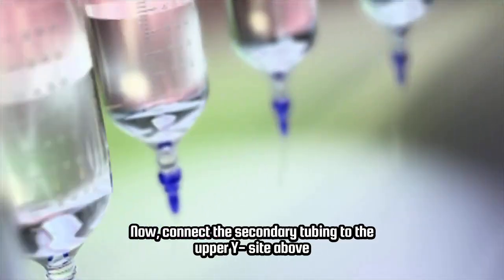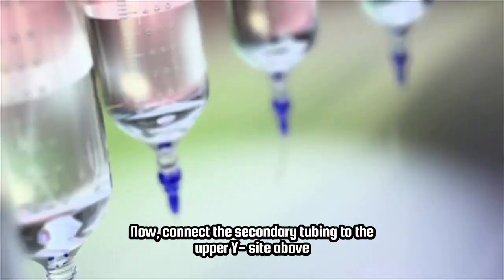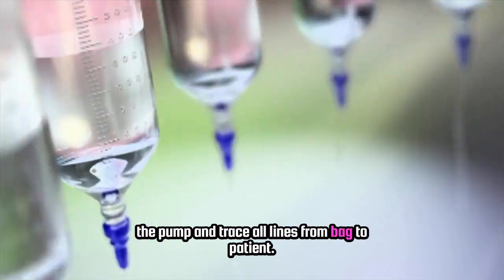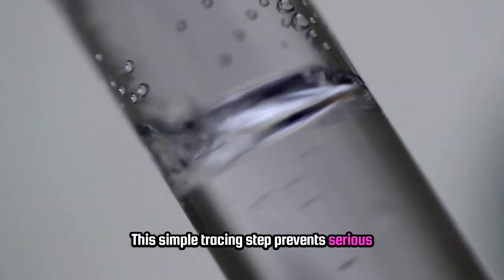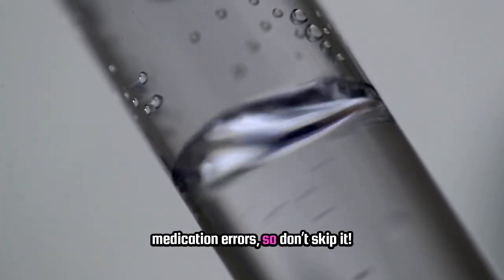Now connect the secondary tubing to the upper Y-site above the pump and trace all lines from bag to patient. This simple tracing step prevents serious medication errors, so don't skip it.